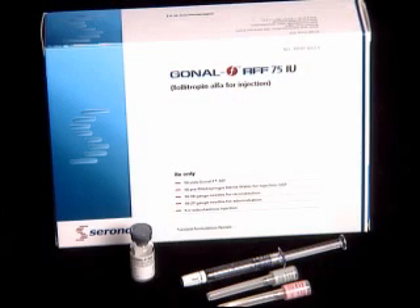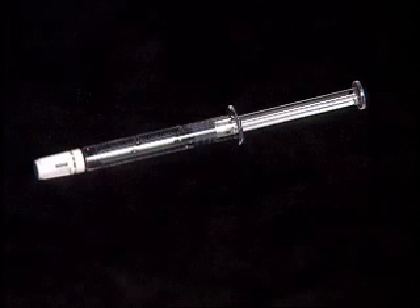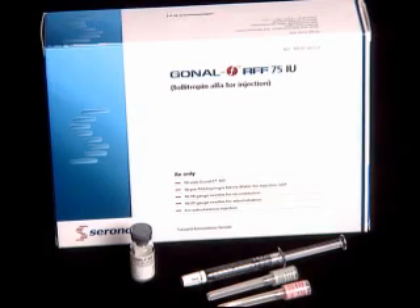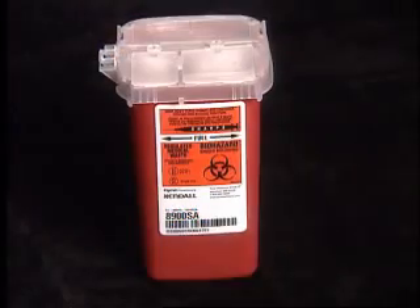The supplies needed are the vial or vials of Gonal-F RFF, depending on your dose. One vial of medication equals 75 International Units. Also needed: one 1cc pre-filled diluent syringe, one 1½-inch pink needle, one ½-inch gray needle — all included with the Gonal-F RFF — plus alcohol wipes, sterile gauze pads, and a sharps container.